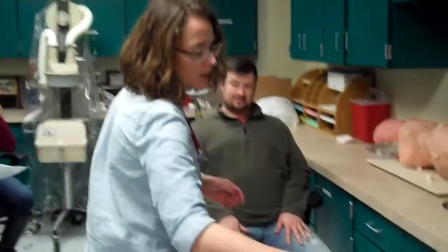Alright. If you do start feeling a little jittery or anxious, sometimes it happens after. Just let your nurse know. We'll get back up here. Okay. Alright. Perfect. And I'm going to leave this stuff back in here, and I'm going to wash my hands, and I'm going to walk out, and I'm going to chart everything that we did.